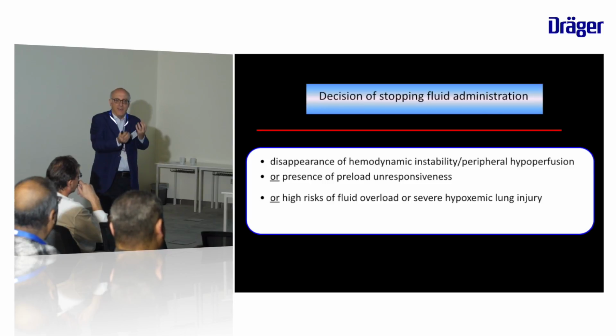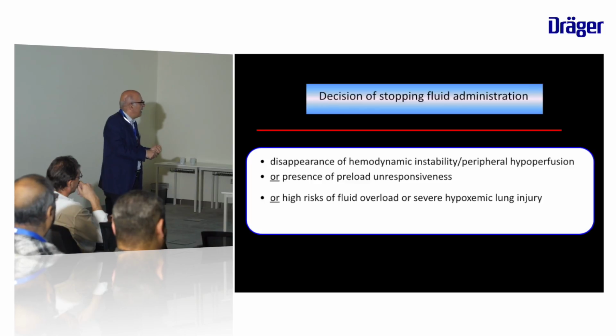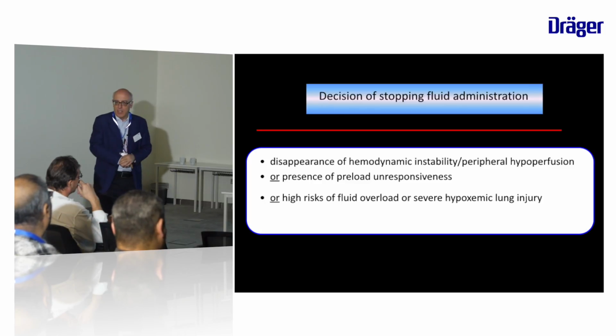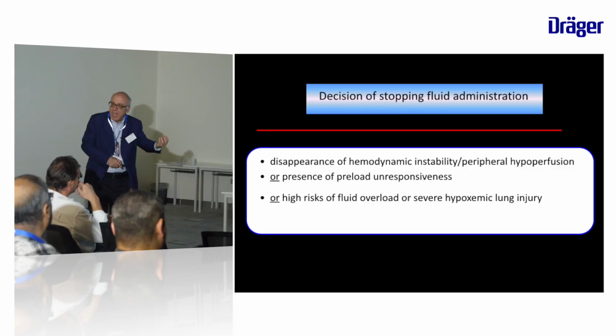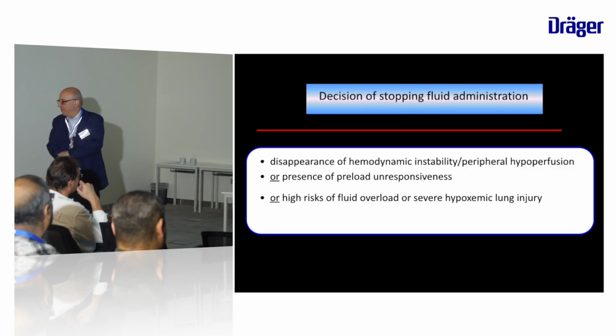So I think we should balance the decision to start to be extremely cautious, and the decision to stop, if you have the disappearance of this, independently from preload unresponsiveness, might be a guide to stop the treatment. Okay?